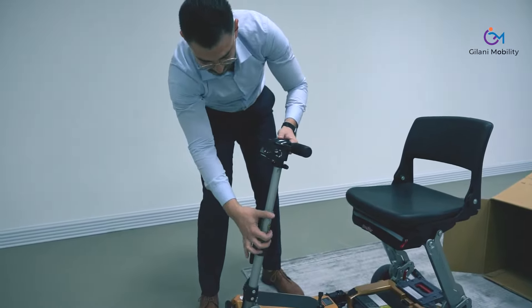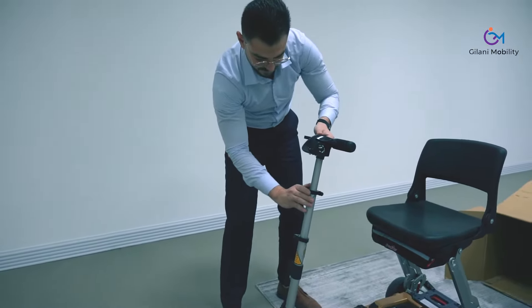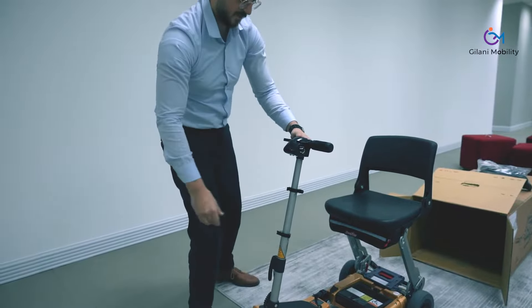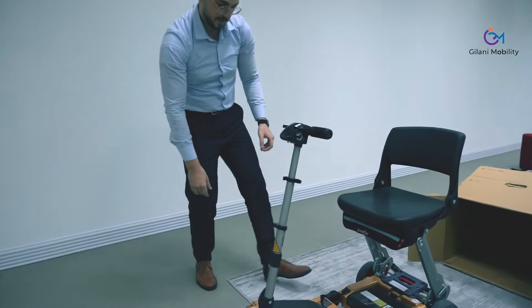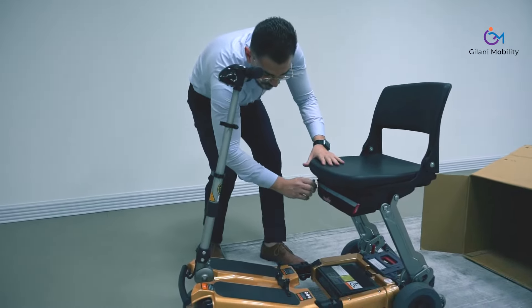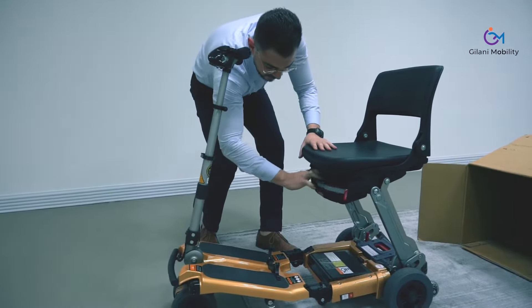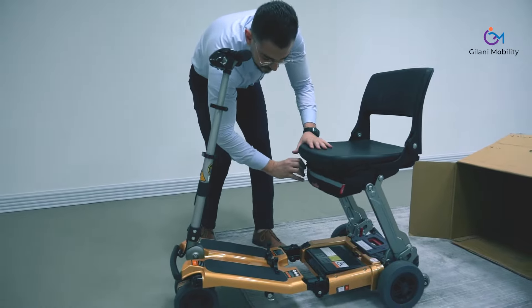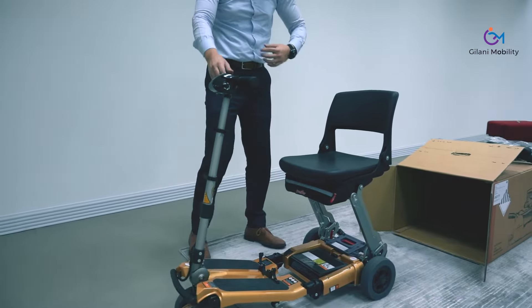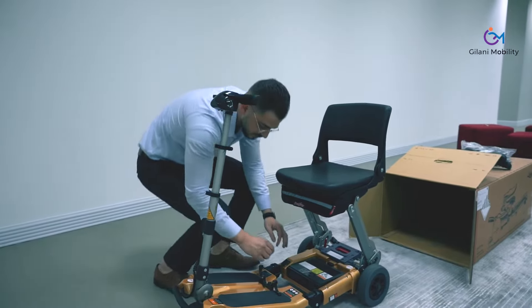The handlebar is double telescopic to be suitable for different users — you can adjust it up and down. Under the seat you have a nicely and conveniently located storage compartment to keep your most important valuables safe, such as your boarding pass, passport, phone, wallet, and so on.